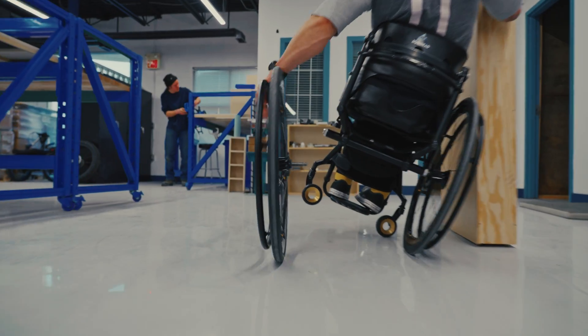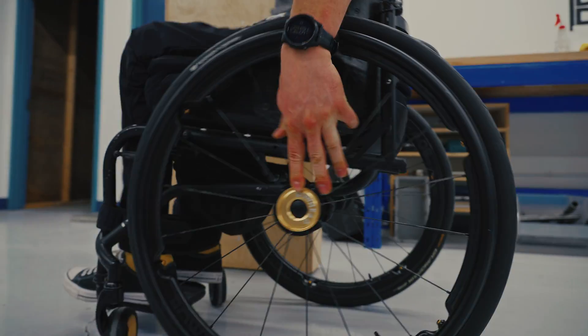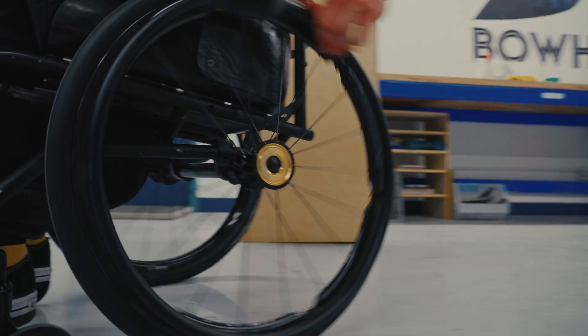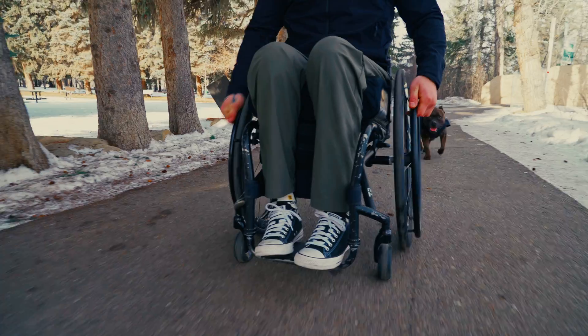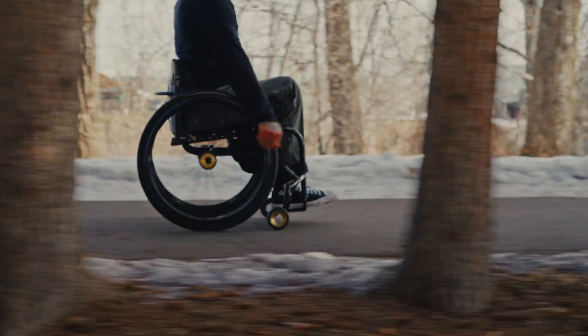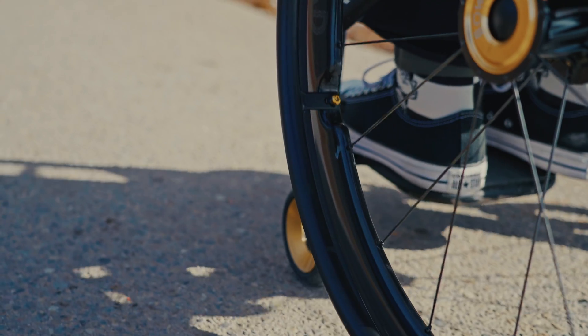Buckle up everyone because today's video is going to be wheelie exciting. We'll be exploring the brand new rear wheelchair wheels by Bowhead World, the 559s. They are more than just a wheel — they're a revolution in design and performance. Where a circle meets destiny, where rubber meets the road, the 559s have it all.